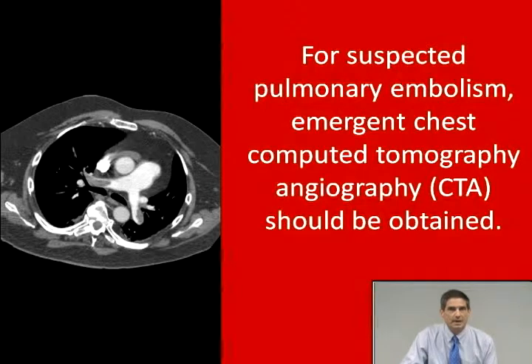The third point is that in those patients that have severe shortness of breath, severe chest pain, and for those reasons or for any other reasons are suspected to have a pulmonary embolism, emergency chest CT angiography or CTA should be obtained.